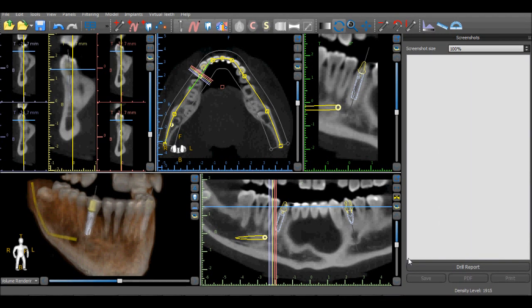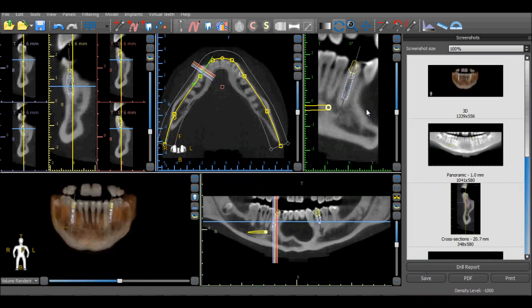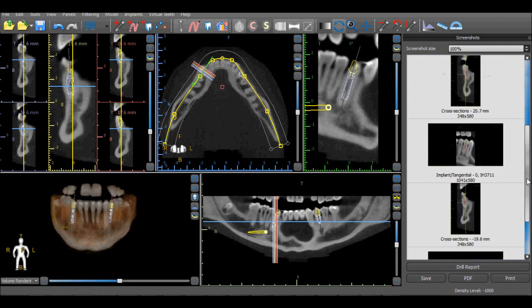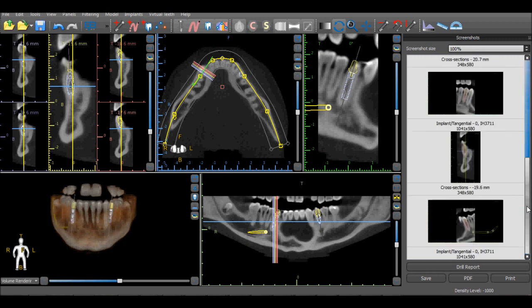The Drill Report button will insert images into the screenshot basket that pertain to the implants placed on the screen. Images from all the different views reflecting the implant position will be added to the basket.